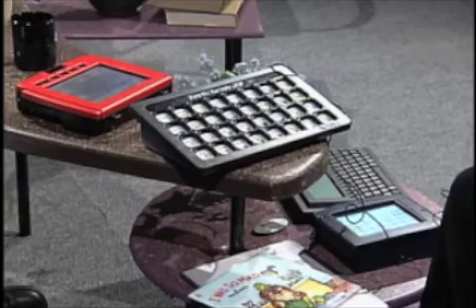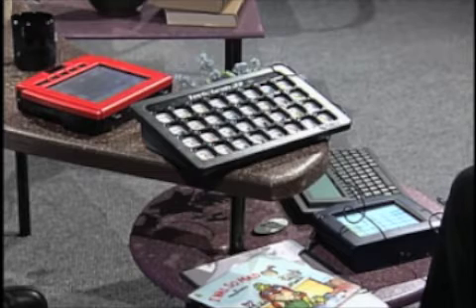And it gets more sophisticated as the person's needs develop? I mean, can you get a button that says, I'm going to write a check, or I'm going to pay by credit card or something? Absolutely. So these systems, the one that I'm showing you here today, is quite limited. There's only a limited amount of vocabulary or messages that the person can access. But we really work up to the other end of the spectrum with the technology that is very computer-based, using touch screens and dynamic display screens, where clients can type out full messages.